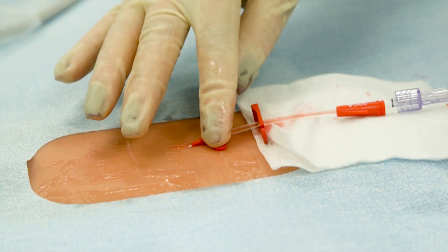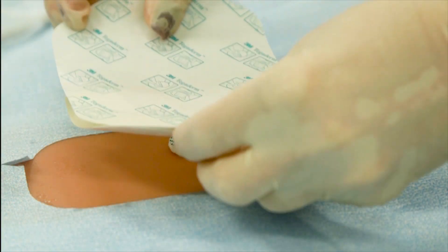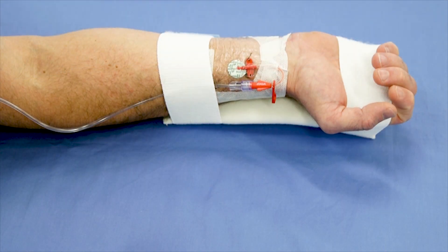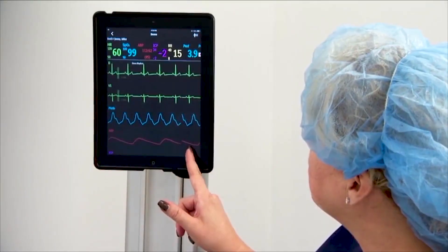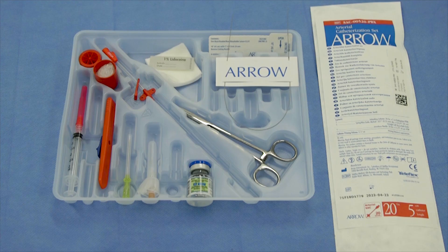Attach a pre-flush pressure transducer tubing setup or stopcock assembly. Secure the catheter to the skin. A chlorhexidine-type dressing can be used for additional bloodstream infection protection; see the CDC guidelines for more details. Cover the exit site with a semi-permeable membrane dressing. Avoid looping the pressure tubing over the patient's thumb to minimize catheter malposition and dislodgement. Connect to the patient monitor, level and zero to phlebostatic axis. For more information on the Arrow Seldinger arterial catheter, please visit aeroarterial.com or contact your Teleflex vascular sales representative.